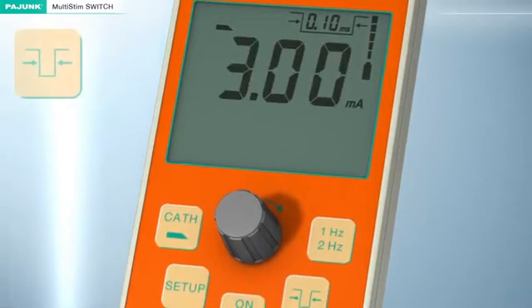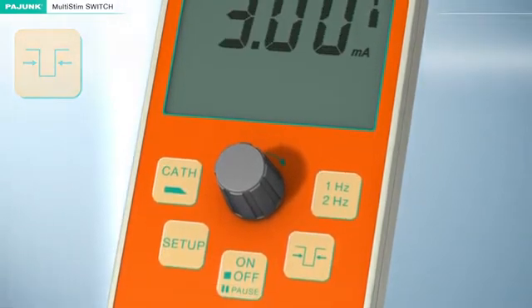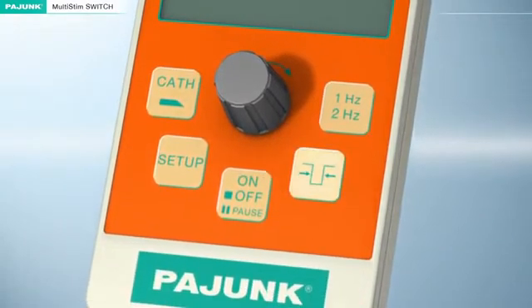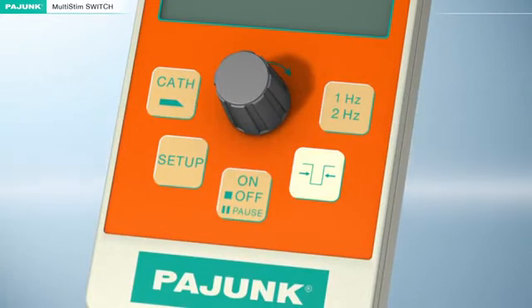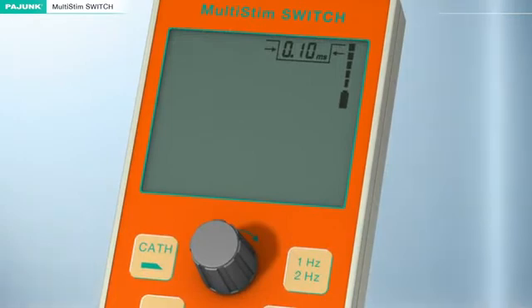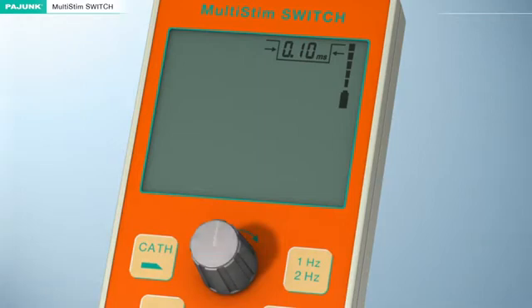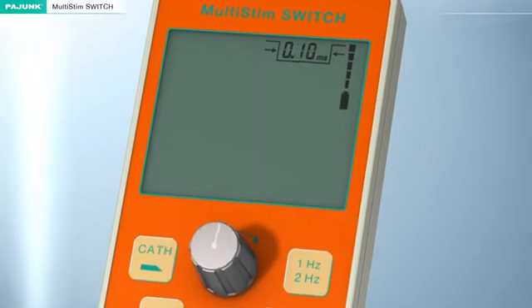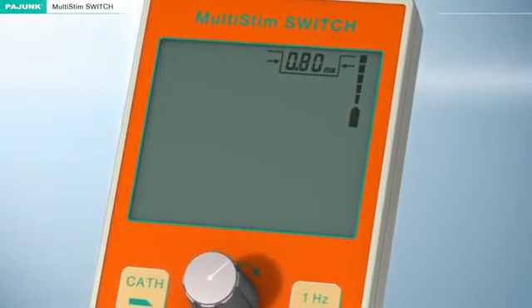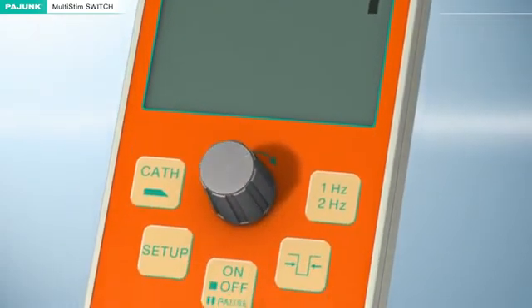Pulse Width: The bandwidth of the stimulation impulse can be changed by pressing this button. The value of the current intensity and the milliampere dimension will disappear from the display. Now the stimulation impulse bandwidth, indicated in the upper right-hand corner of the display, can be adjusted to the desired value between 50 microseconds and 1.0 milliseconds with the aid of the turning knob.